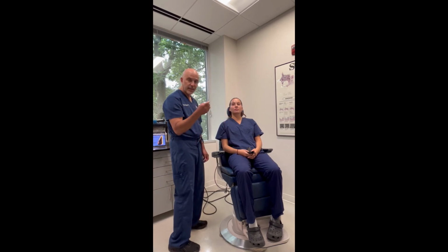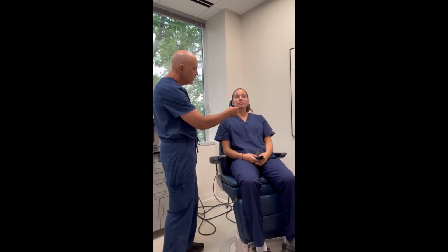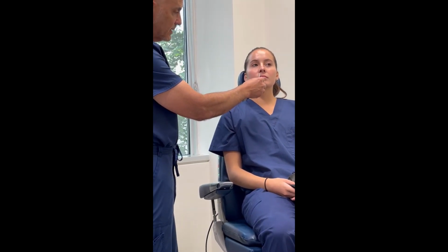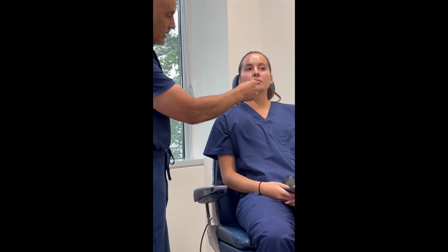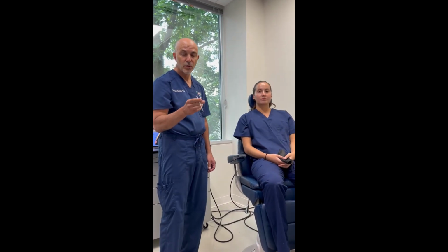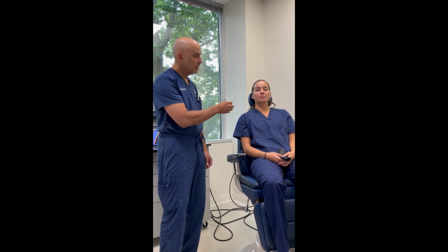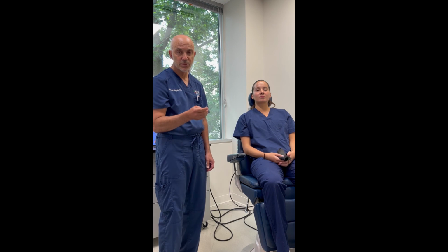Then we take the handpiece for the VivAer, which I don't have one, but I'm going to simulate with this, and we get in under this cartilage and lift it out as we cauterize with the radiofrequency generator. We do it in 3 different areas, and one of the more incredible things about this procedure is that most patients will notice a difference in their breathing even after one of the 3 treatments. So it's quite a successful procedure.